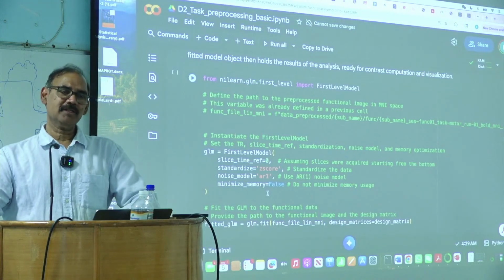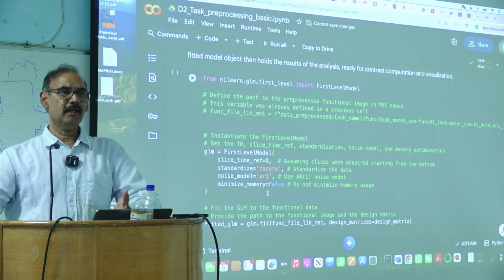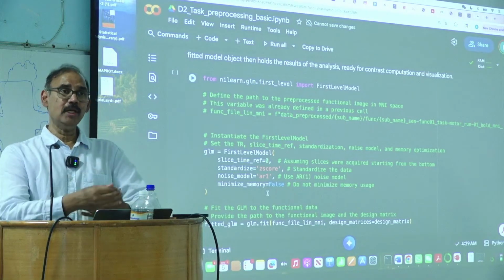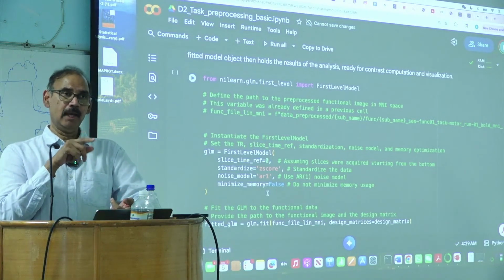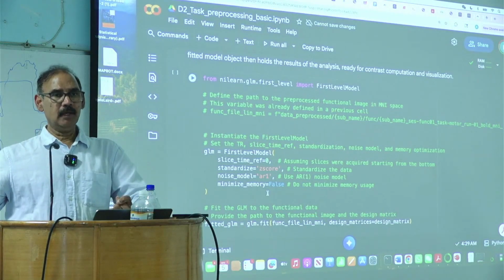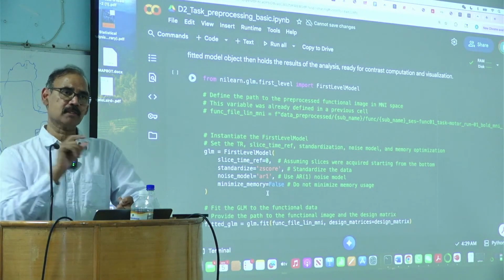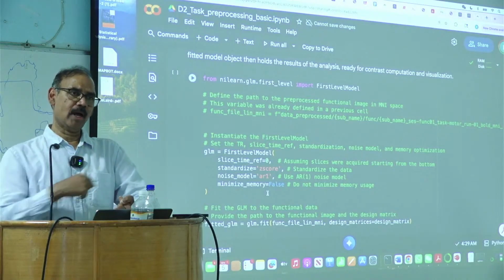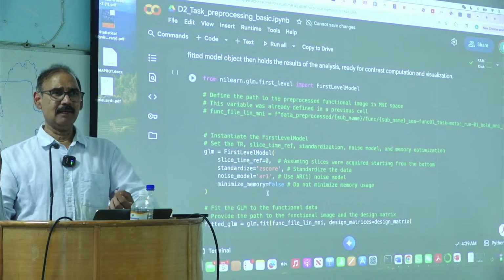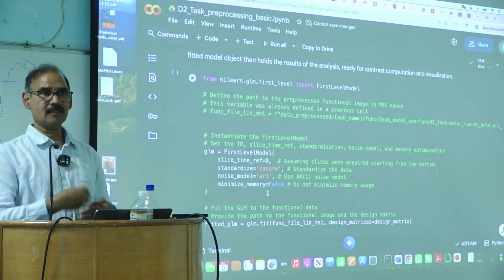Autoregressive means that the current value is dependent on the past value. It doesn't have to be wholly dependent. It could be x_i equal to random noise plus alpha times x_(i-1). So alpha is how much dependence you have. If it is, let's say, 0.1, then it's a small amount, but if it's 1, then it has a much bigger effect.